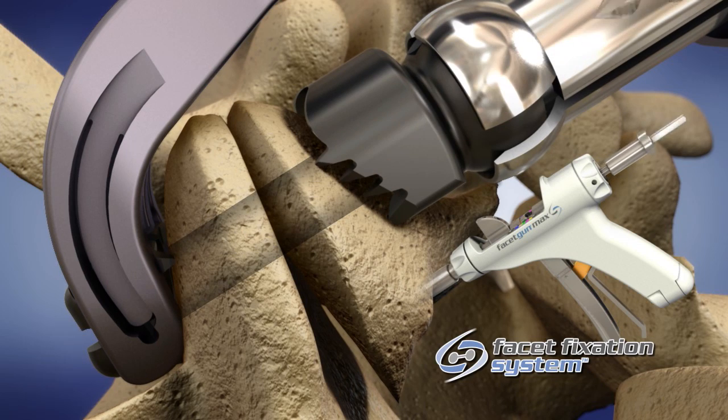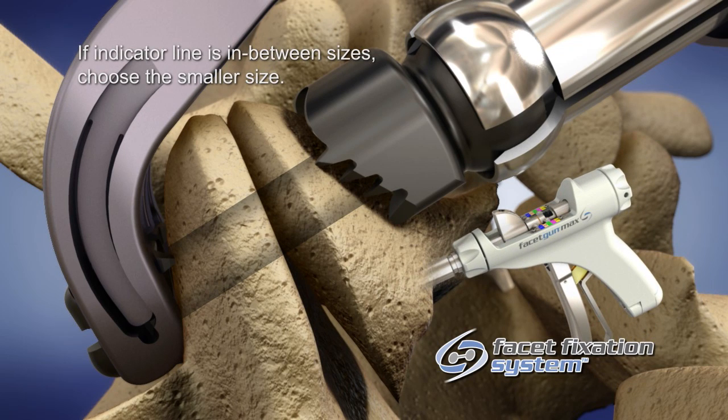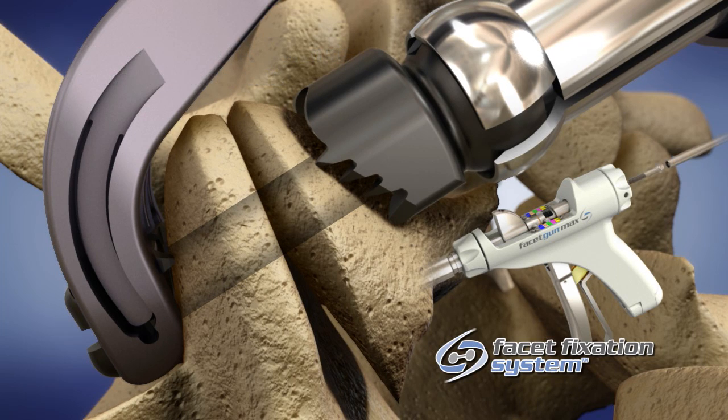Select the appropriate screw length by matching the color or length indicated on the outer package with the color or measurement taken from the handpiece in the previous step. Load the screw by inserting the hex head into the hex end of the driver and thread the retaining knob clockwise until finger tight.